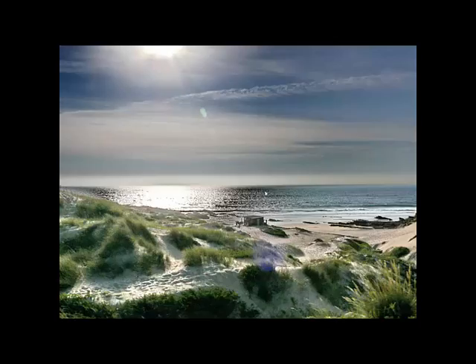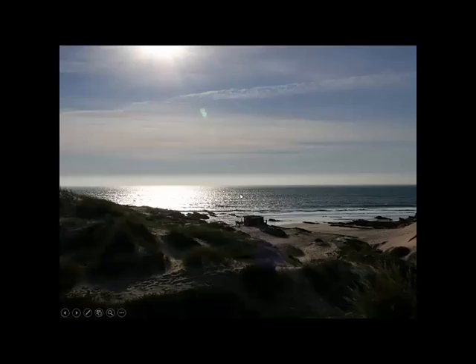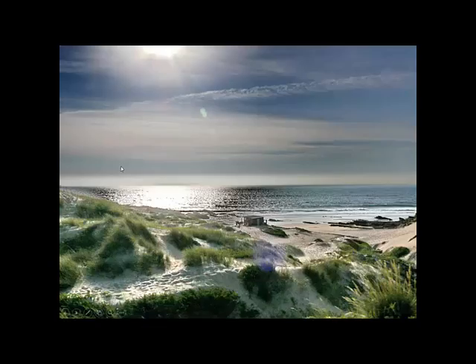So what we see here is we introduced an artifact in the image that didn't exist, and this is just an image processing artifact. The same here, where we see a brownish frame between the white area here and the sand here. This brownish frame is called edge artifact. It does not exist in the raw image as we see it, and this is an artifact that is quite dangerous in medical images.